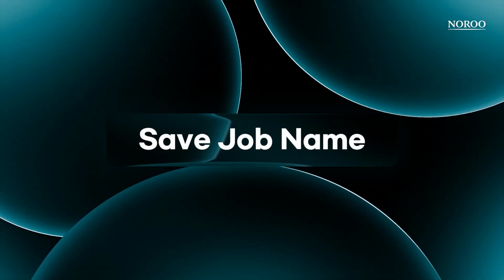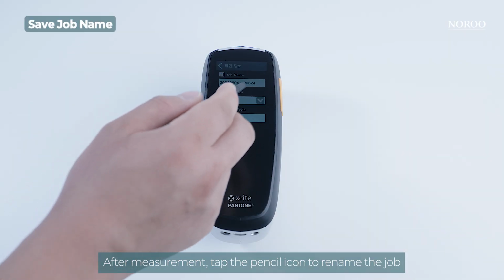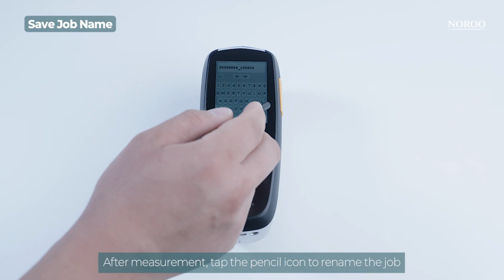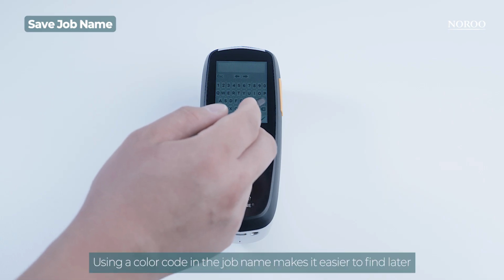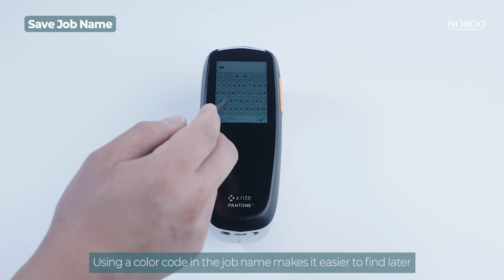Save job name. After measurement, tap the pencil icon to rename the job. Using a color code in the job name makes it easier to find later.